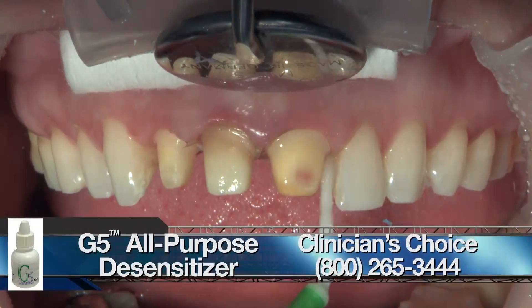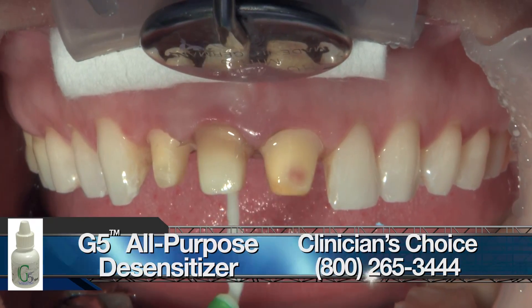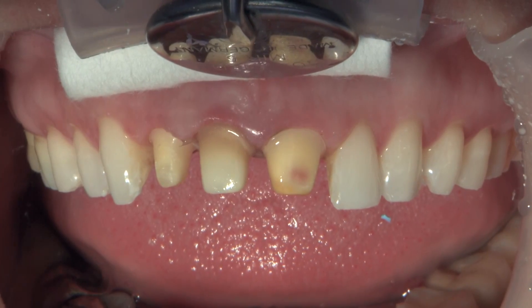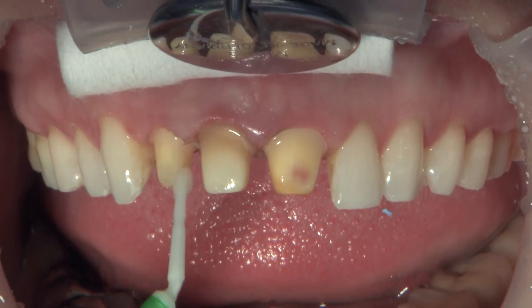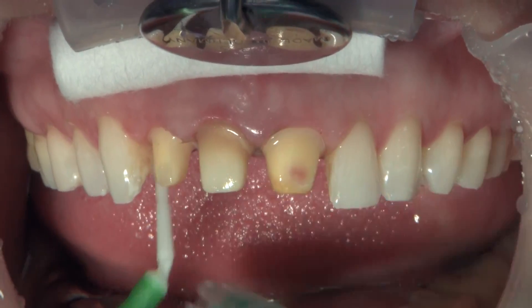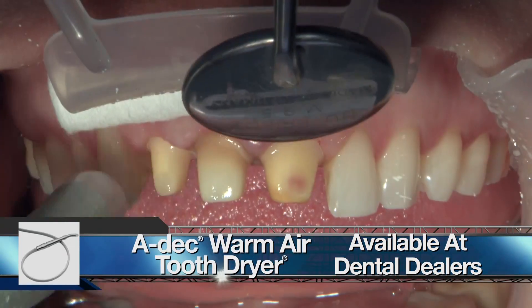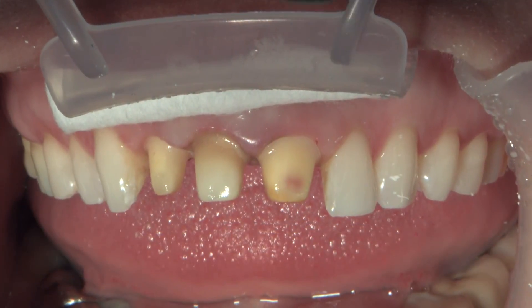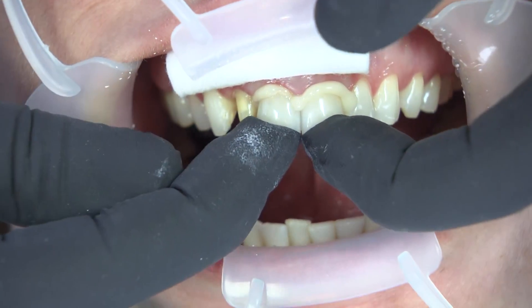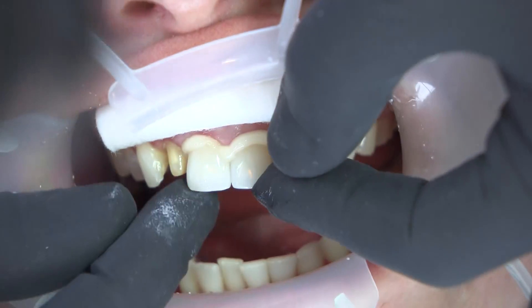This is G5 — a combination of 35% HEMA and 5% glutaraldehyde from Clinician's Choice. This is going to stop just about any chance of postoperative sensitivity. We put this on, wait one minute, then suction it off with high volume suction or blow gently with an A-dec warm air tooth dryer so we don't blow it onto the tissue. Then we put a second coat and leave it on for a minute again. This will fix the tissue, prevent sensitivity, and kill 99.9% of bacteria that might be living on those preps.